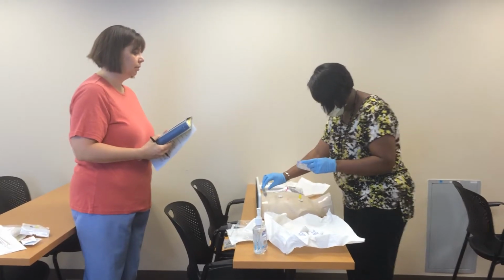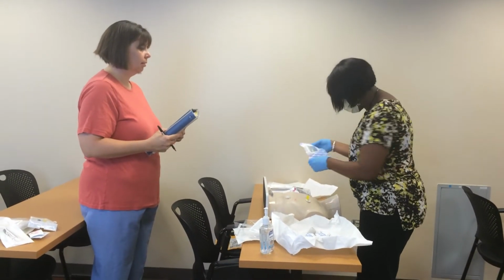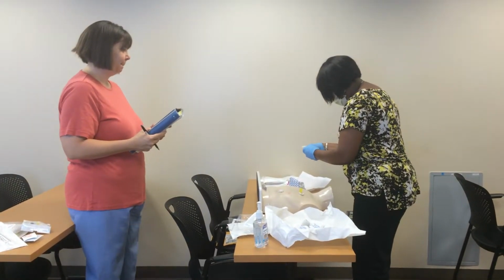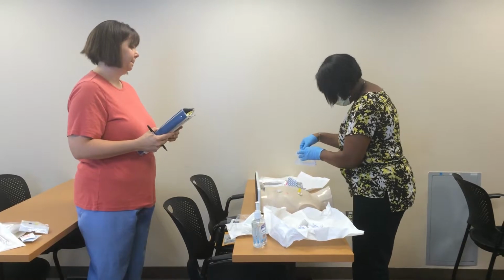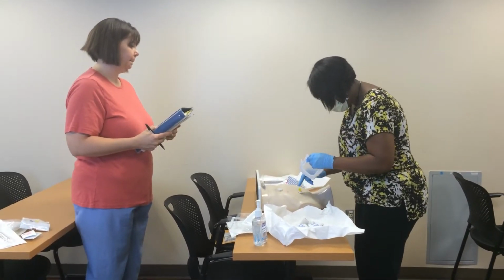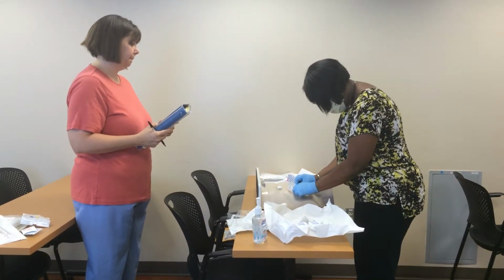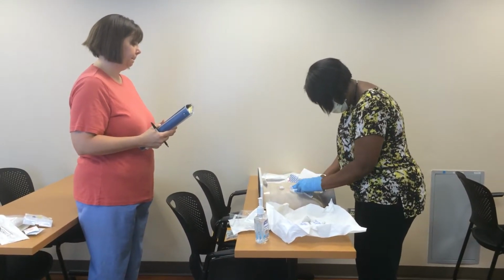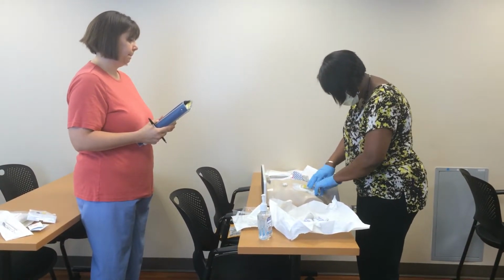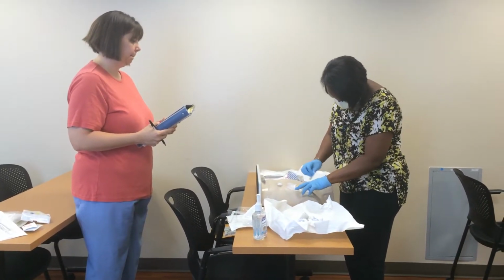So lay this here on your chest. You said you're not allergic to this type of dressing, so. I'll put the date and time here for you, when this was last changed.